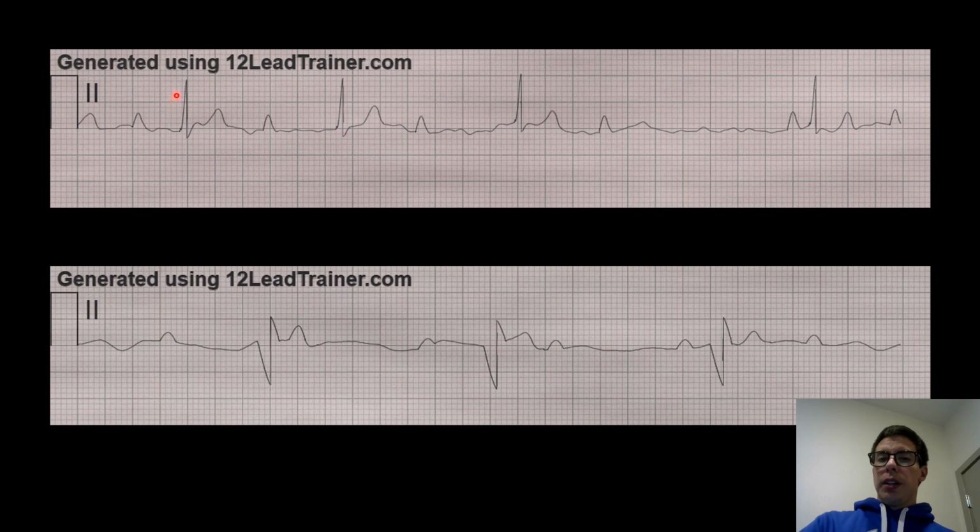So doing it the other way that we do for an irregular rhythm, it would be 1, 2, 3, 40 beats per minute. I don't think it's quite that slow. I don't really want to consider it an irregular rhythm, because then we have to count it that way and the pulse would be way too slow. However, according to counting regularly, it is below 60, so it's in the 50s somewhere, and doing it the other way says 40. So we could call this between 55 and 60-ish. It's not 60, but the mid to high 50s. And I think that'd be accurate.